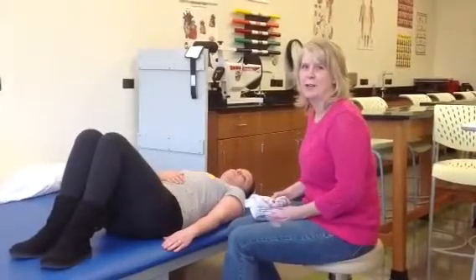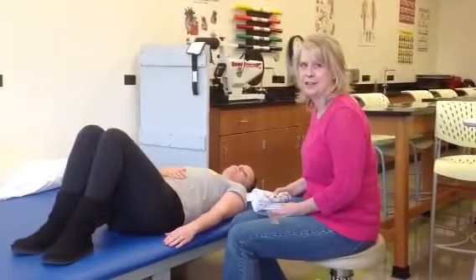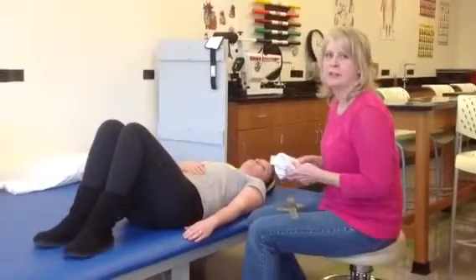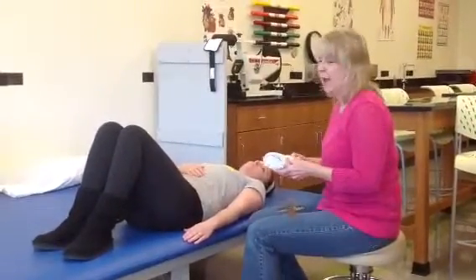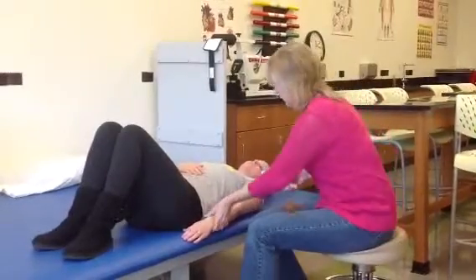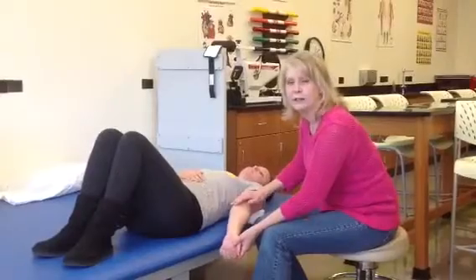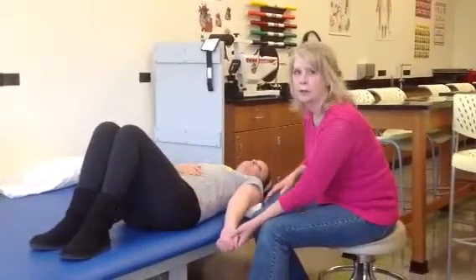Hi, today we're going to be measuring the elbow flexion and extension of our client that we have here today. First of all, we're going to have the patient lying on the table in a supine position, and we're going to take a towel and put it underneath her humerus so that this will allow her arm to freely extend, and we can get a really good measurement on that.